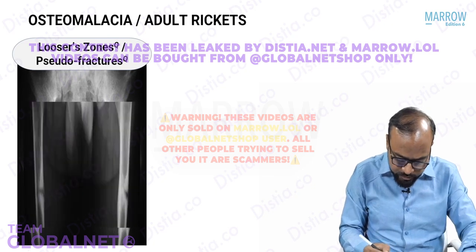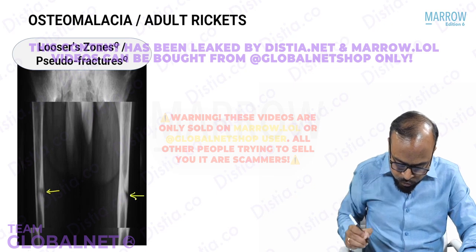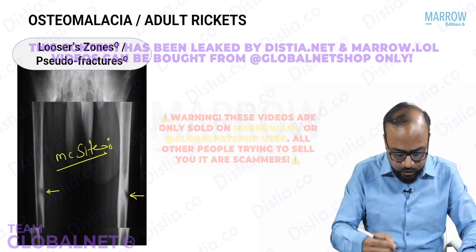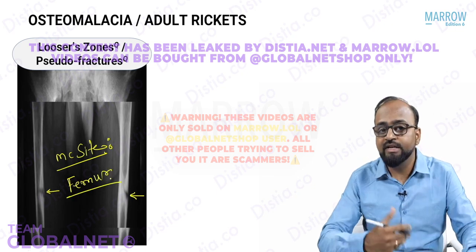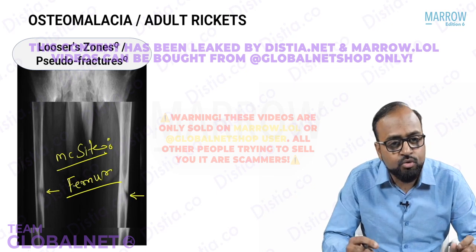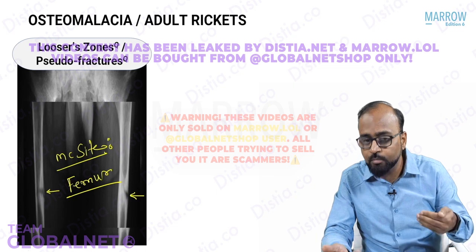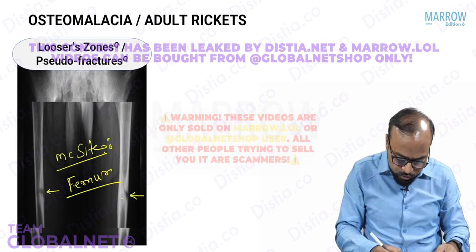If you see in this particular image here, can you see the horizontal transverse bands there? So the most common site of involvement of these Looser zones or pseudo fractures, because of weakening of the bone, is usually the femur. They are commonly seen involving the neck of the femur, but here they are seen involving the femoral shafts. So there is diffuse osteopenia. Bone mineralization is decreased or abnormal. There are transverse defects involving the cortex. These are called Looser zones or pseudo fractures.